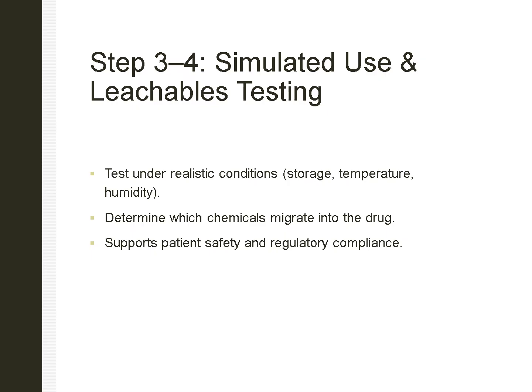Then we move to leachables testing under USP 1664, using long-term or accelerated aging studies. Here, we identify which chemicals truly make their way into the drug and how much. The data directly informs risk assessments for patient exposure.